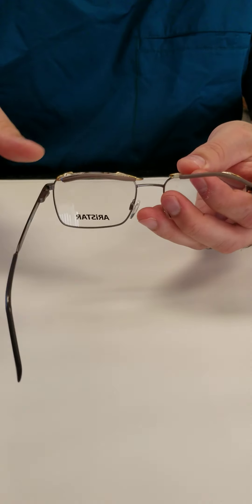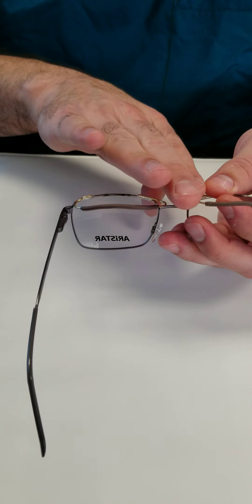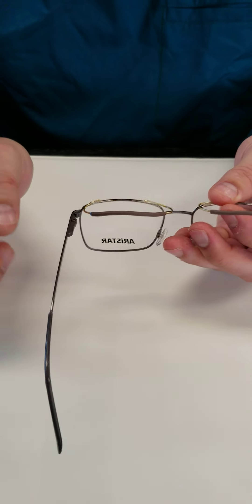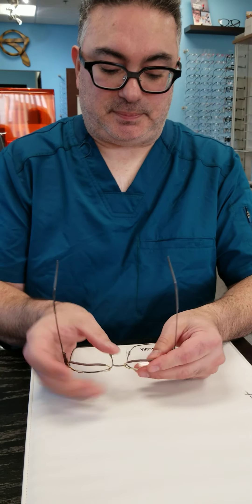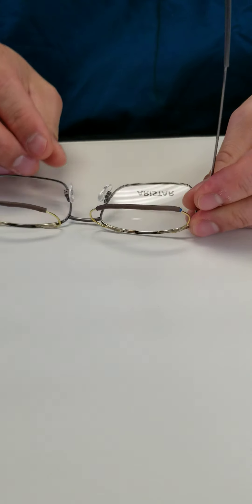This is Al from Crystal Eye Care. We're going to go over in this video how to adjust the ptosis crutch. Ptosis crutches always should have this bend right here — on the top it should basically contour the top of your brow.